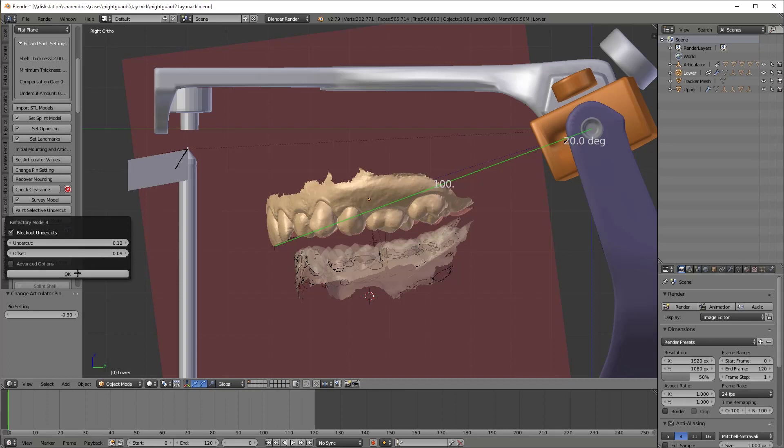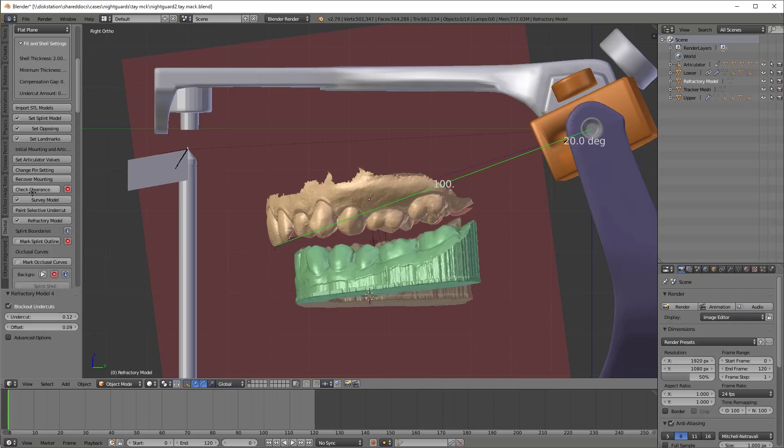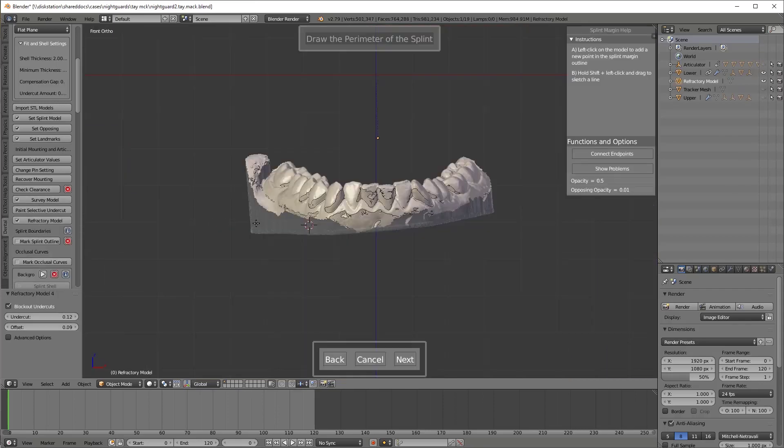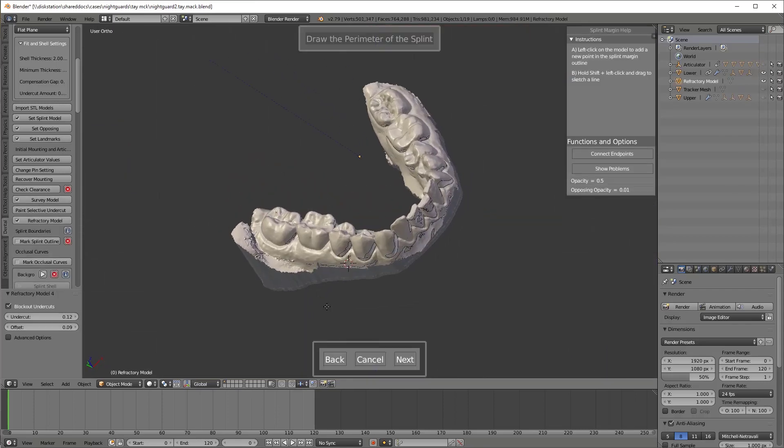Now we're going to do a refractory model. This is a duplicate model with all the undercuts made to it. And then the splint outline comes next.